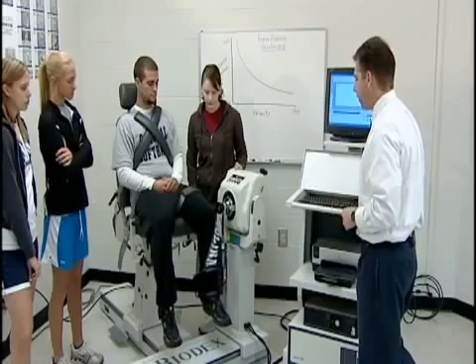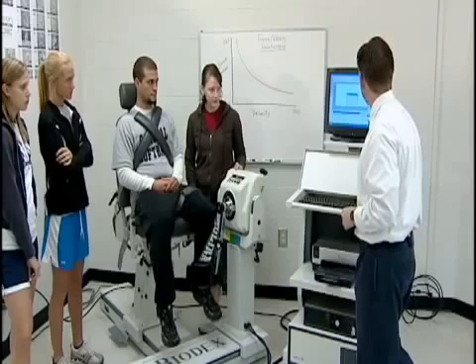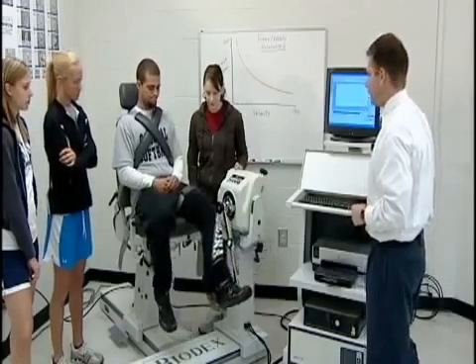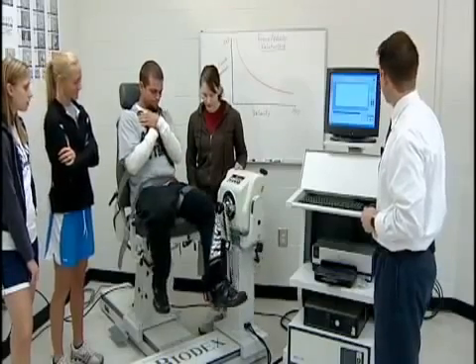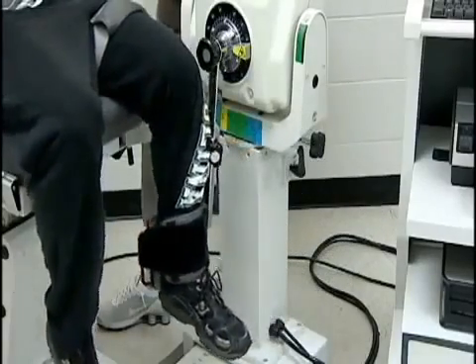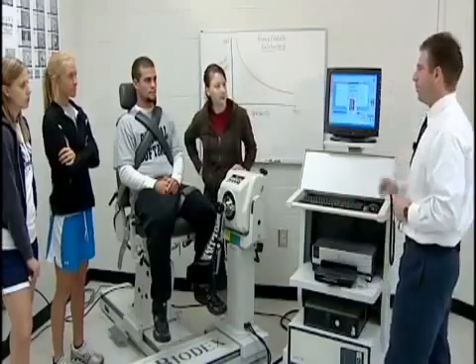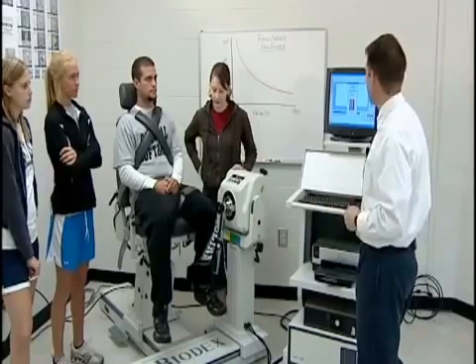Starting at a medium speed of about 60 degrees per second. Zach takes his leg all the way back and performs the test — kicking and pulling through the full range of motion. The quadriceps were probably about 30 to 40 percent stronger than the hamstrings, which is normal given that there are four muscles in the quadriceps versus three in the hamstrings muscle group.